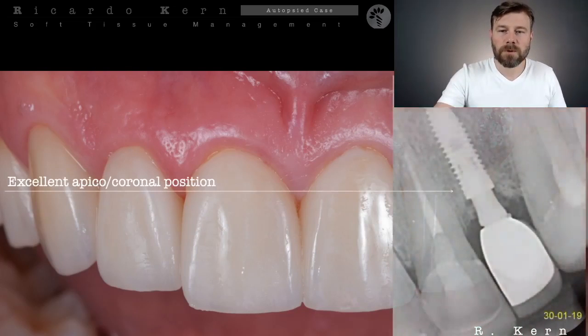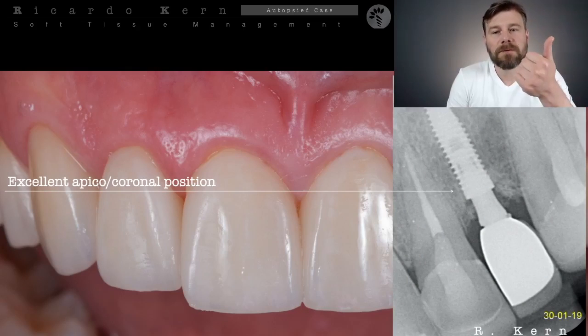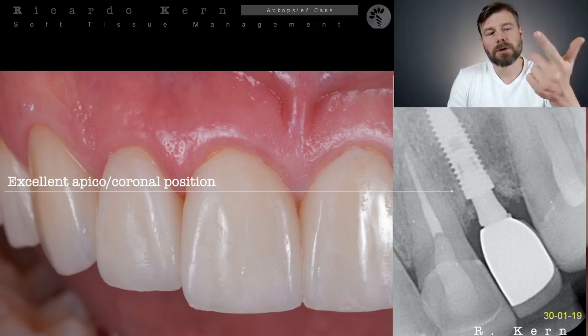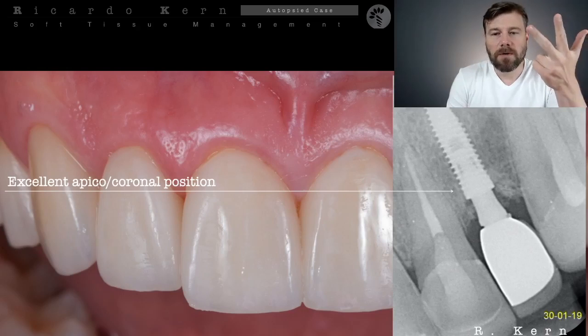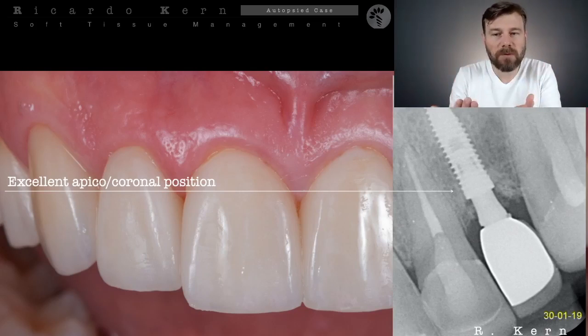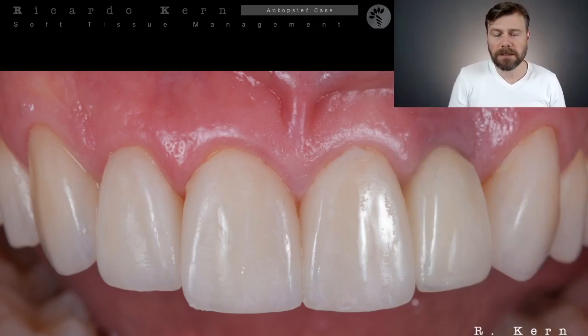Okay, good. X-ray evaluation. No bone loss around this implant, no peri-implantitis, no pocket on this area, probing a healthy tissue. I can really work on this environment that is very prone for me to have a good result for my graft.